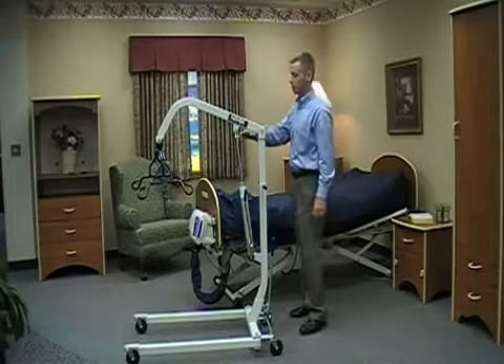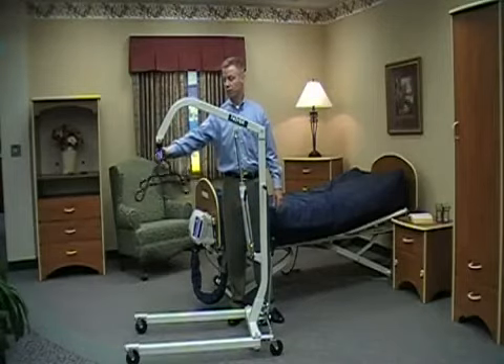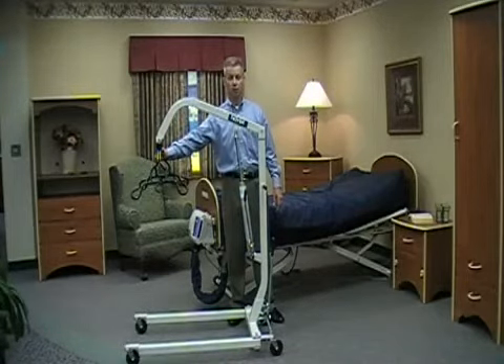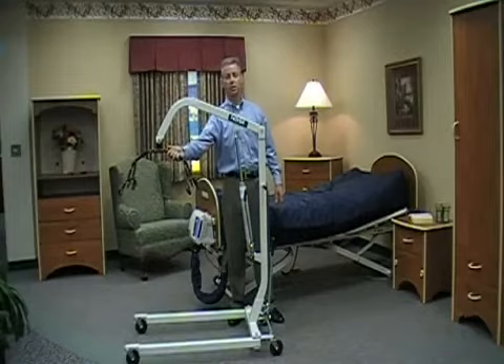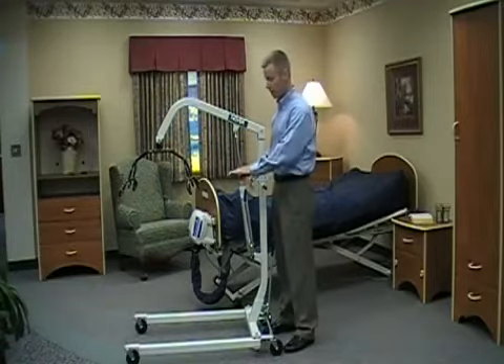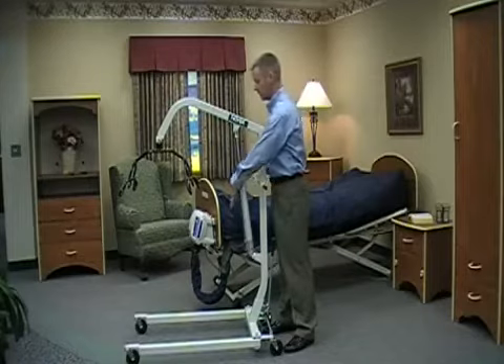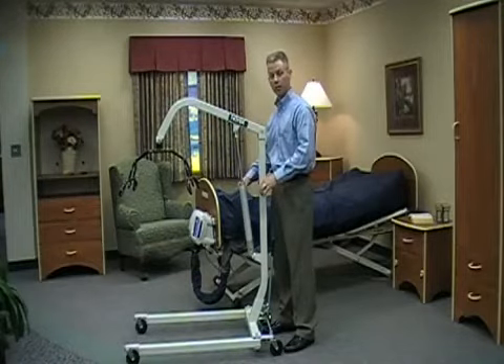The HML 400 has a four point cradle, and it's actually got a 360 degree pivot, which allows you to approach from the front for chair to bed transfers, and likewise from the side for bed to chair transfers or anything else that you were going to do. It's hydraulically operated, and you have a hydraulic pump where my left hand is. That pump is actually operable on the left side or on the right side, depending on your preference and where you're located during the lift or transfer.